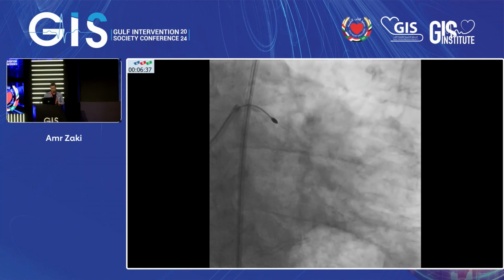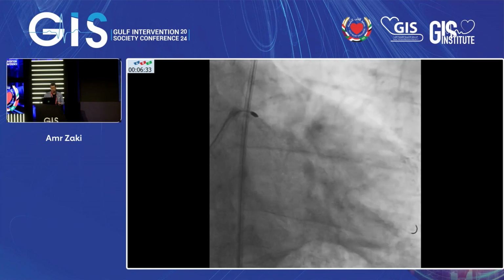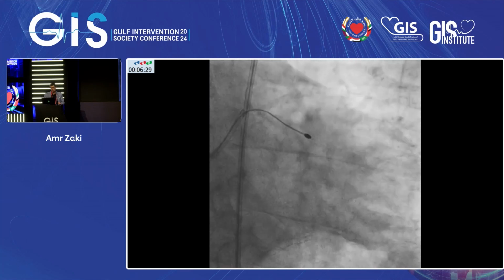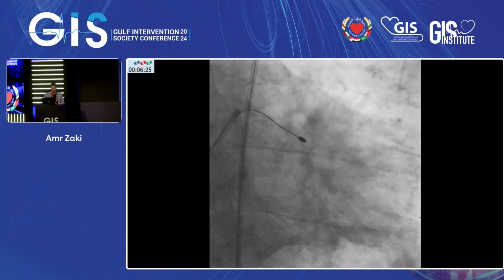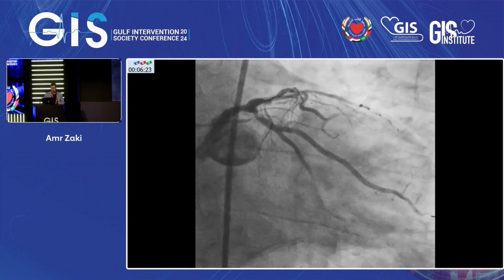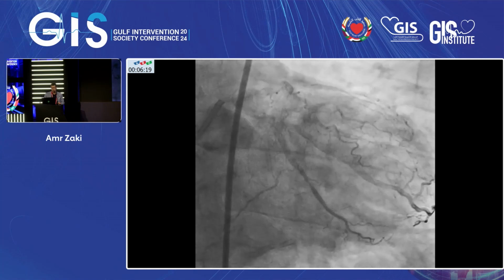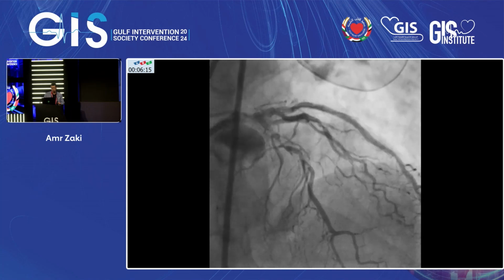This is the rota, 1.5. It crossed a little bit with high speed, then lower speed to ensure good ablation. After that, I took the balloon, and it was okay with a 1-to-1 balloon. Then what's next? Stent the LCX, or change to the LAD, get the wire off and go to the LAD. The LAD is more complex.